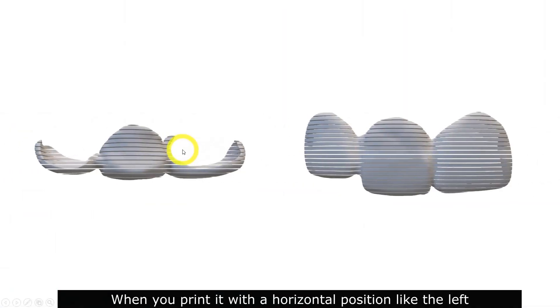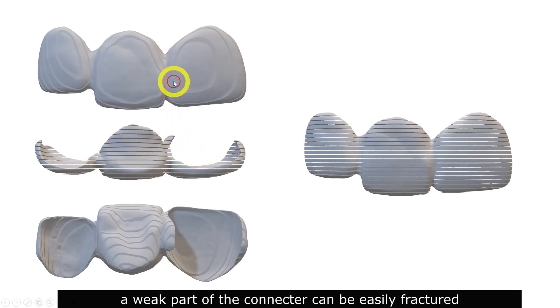When you print it with a horizontal position like the left, a weak part of the connector can be easily fractured because it will create a vertical line.